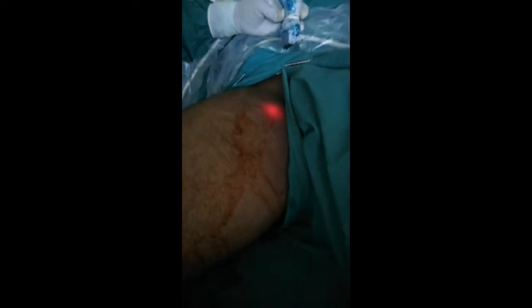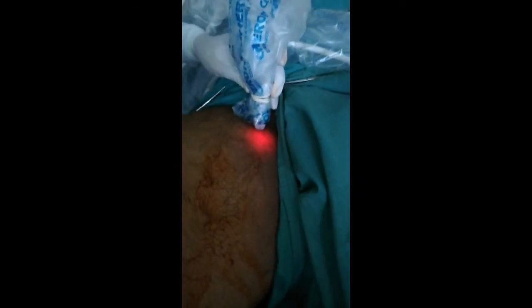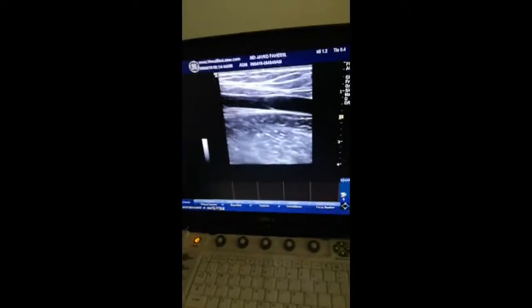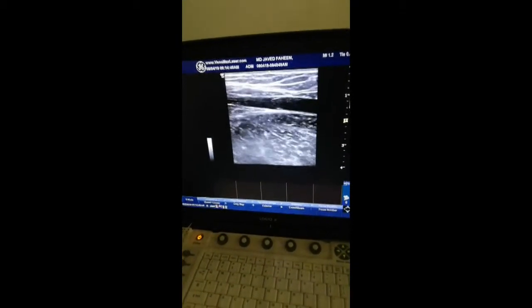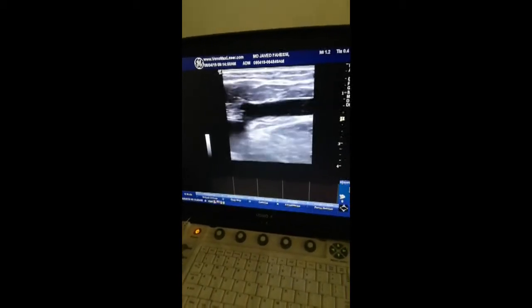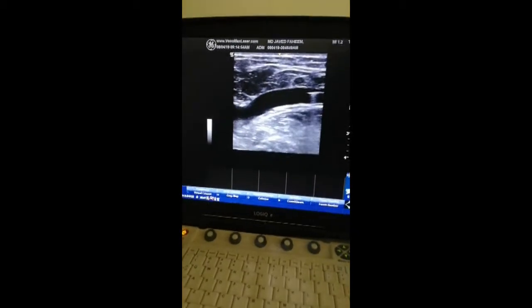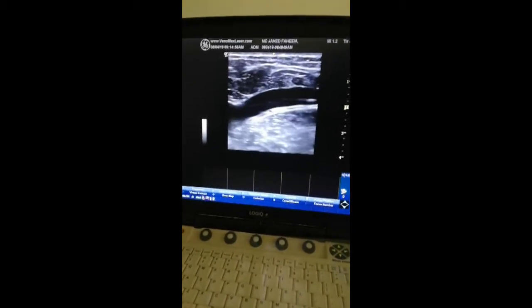You can see the fiber has come into the central femoral area — you can see it on ultrasound. You can see the fiber being pushed, and the saphenofemoral junction is visible now; you can see the fiber entering there.